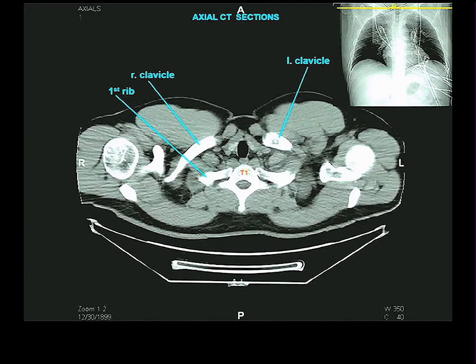And the ability to read a CT of the chest, or an MRI for that matter, requires only 2 things. A good knowledge of the anatomic relationships of the structures in the chest, and an understanding of what looks white, black, or gray. All right? A knowledge of relationships is easily obtained by reading that chapter on core concepts on relationships 20 or 30 times. So then after that, it's only what's water density, bone density, or whatever. Past students have thought, gee, there's something really mysteriously difficult about learning how to read a CT scan of the chest. It isn't. There is no better way to review your knowledge of relationships than to try and read a CT scan of the chest. And that's the only information that's in there, really.